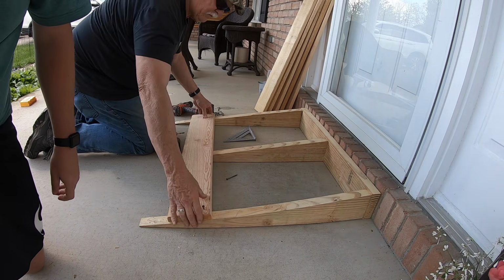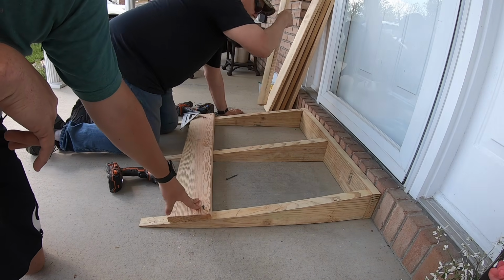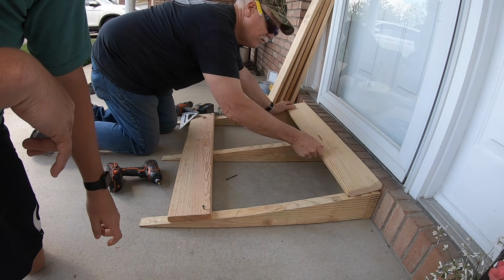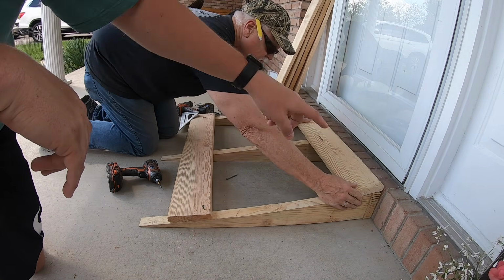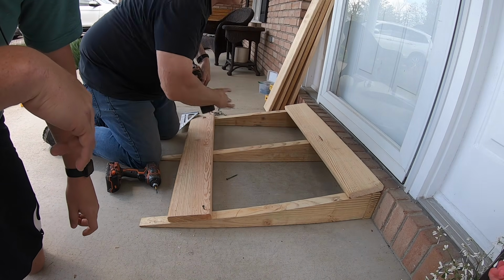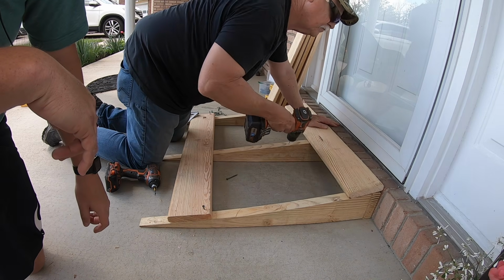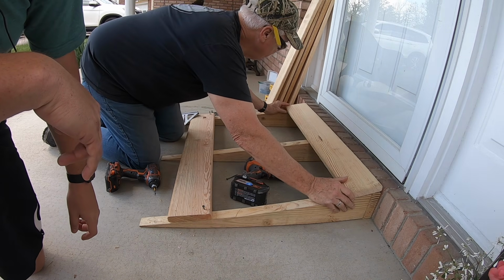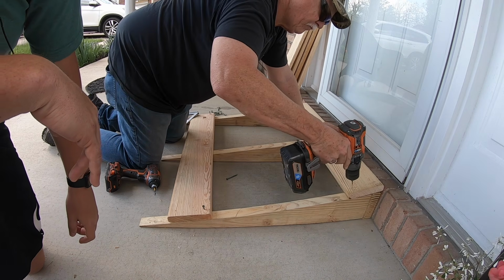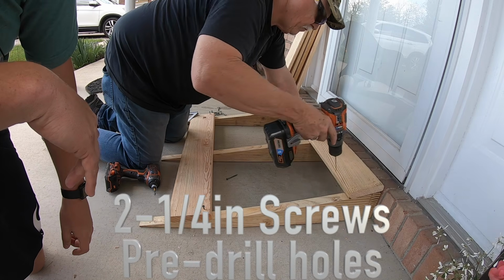Okay. Once you're locked in place, you don't have to go all the way down as well. Once you're locked in place, we're going to go ahead and start with the first board all the way up at the top, and you're going to want to make sure it is right on the edge there with just a touch of overhang if there's any. Then you go ahead and pre-drill again at least the 2 sides. And again, you're going to want to make sure you're all squared up just how you should be before you do any of your pre-drill, but the pre-drill will help it from not breaking the end of that board and splitting it.